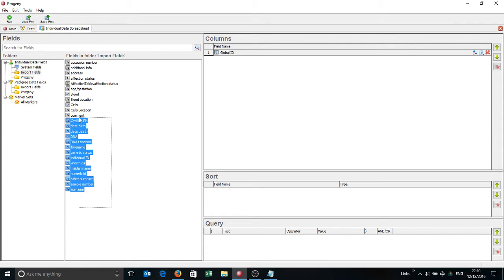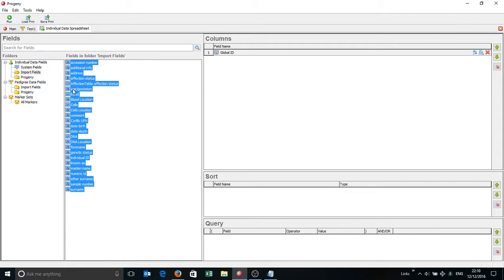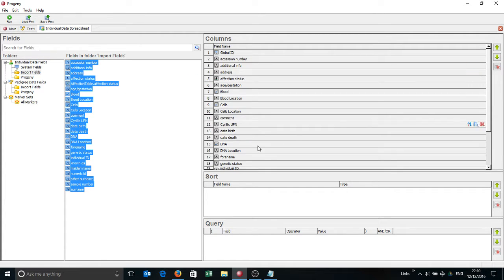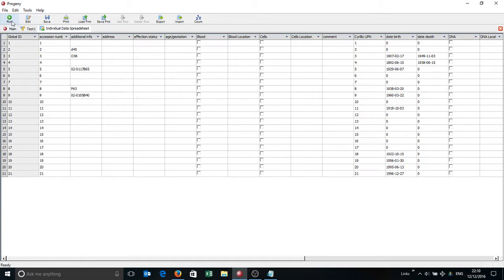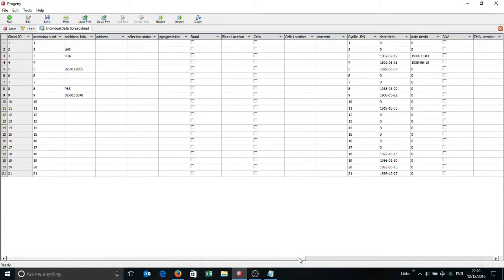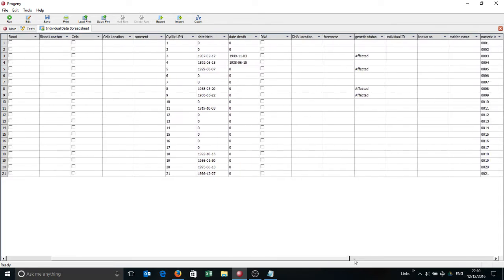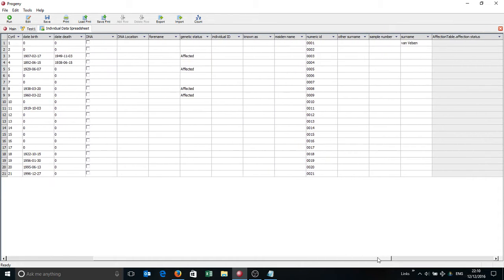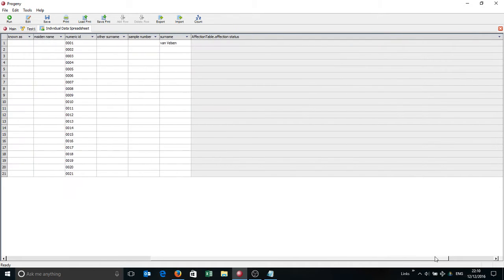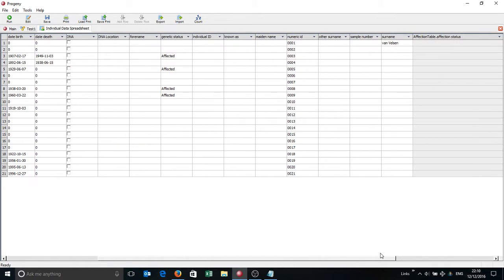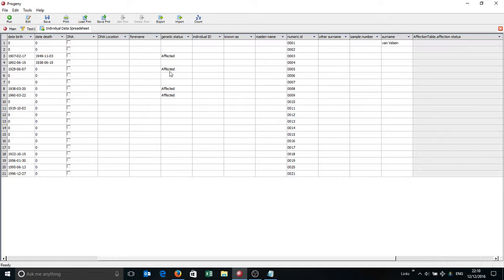I'm just going to choose any identifier, in this case global ID is a simple one. And then I'm just going to select everything in the import fields folder, left click, keep that button held down, and I'm just going to drag and drop it here. And I'm going to run that. And you'll see straight away there's some basic information showing here under additional info. So there's some date of birth, some dates of deaths. And as I come across, you'll see here's the numeric ID, there's one single surname in the database, there's not a lot of information. But there is some affected information here under genetic status.